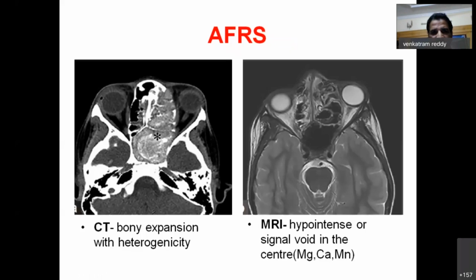So coming back again, for the sake of postgraduates, in allergic fungal rhinosinusitis the plain CT scan has a limited role. You have to go for CT contrast wherever possible, which gives a diagnosis in most cases. If you are still in a dilemma, which sometimes happens in clinical practice, then you can go for MR. That MR shows the signal void areas or hypointense areas, and that gives a clear-cut idea that I am dealing with allergic fungal rhinosinusitis.